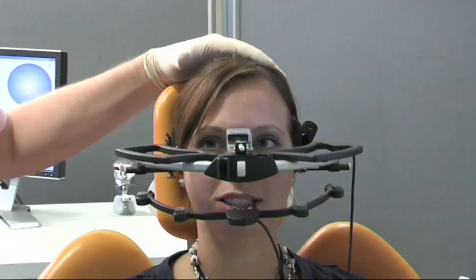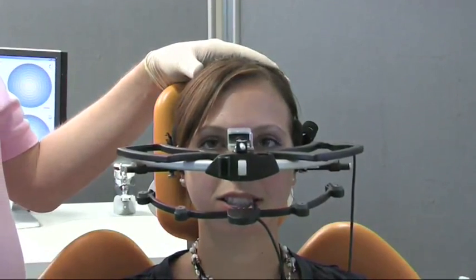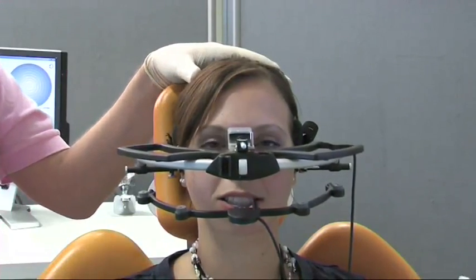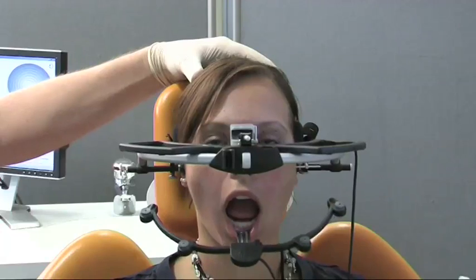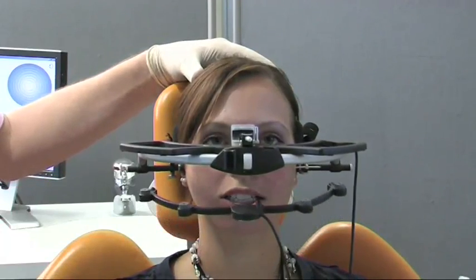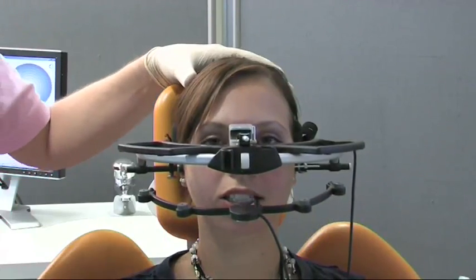Good, very good. Okay, now open your mouth wide and close, making sure the teeth do not make contact. Do this 5 or 6 times. Open and close without tooth contact. Open wide and close with no tooth contact. Open and close, no tooth contact.